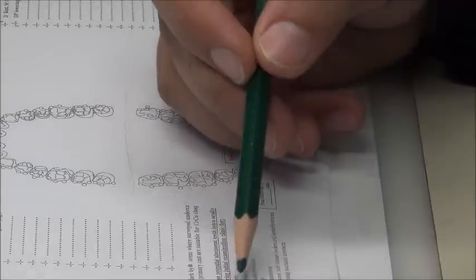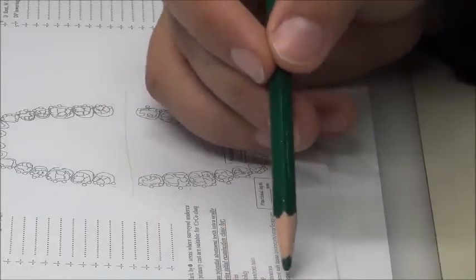Maybe if you have a restoration, okay? On the cast, you can't see the restoration, so you have to write down your restoration on the chart here. And so on. So these are the clinical findings. You are the only person that could find these, and you have to find them from clinical examination.